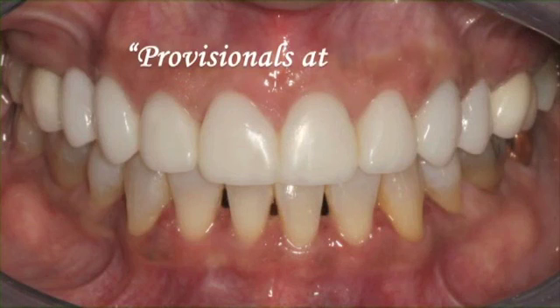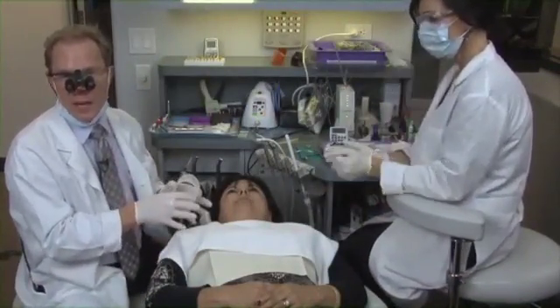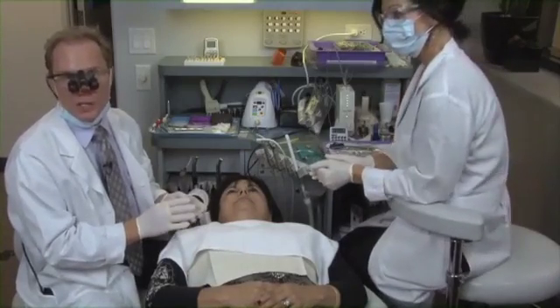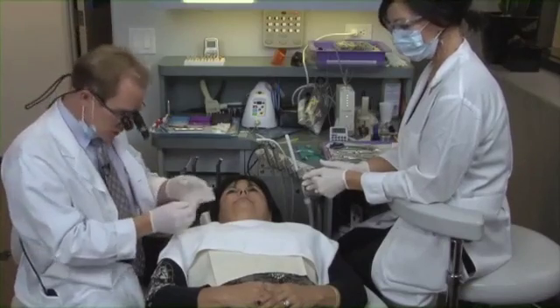She's been in provisionals for the last five weeks. We're going to go and take those off and try in the veneers. During the removal of the provisionals and the try-in, I like to use a cheek retractor. We're actually going to cement or bond the case in under a rubber dam, but this is more comfortable for the patient and allows me to evaluate the overall look of the restorations.